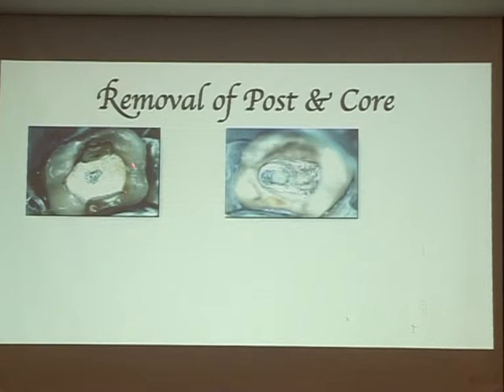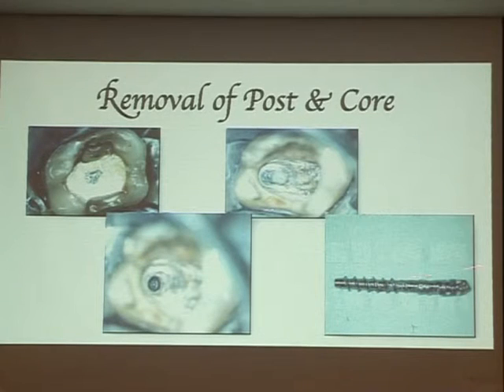Okay. Post and core cases, you can see the core material. Ultrasonic can help you to remove all those core materials, and you use it to loosen the post when you take it out, rather than using a bur to cut.